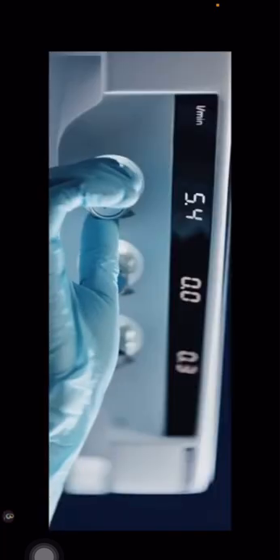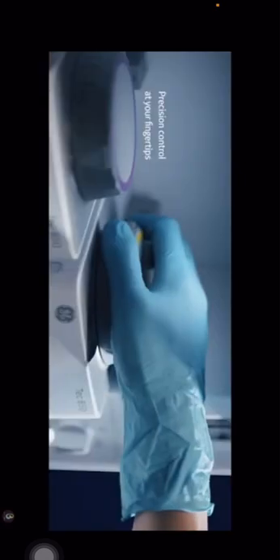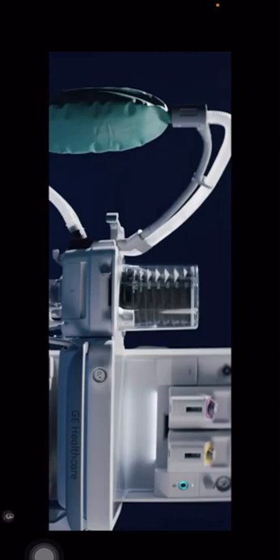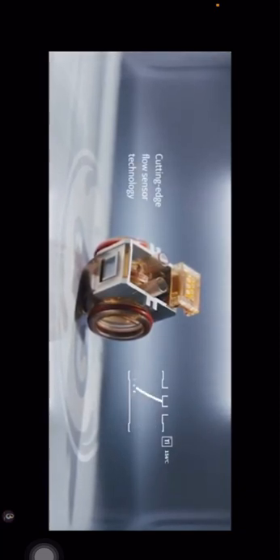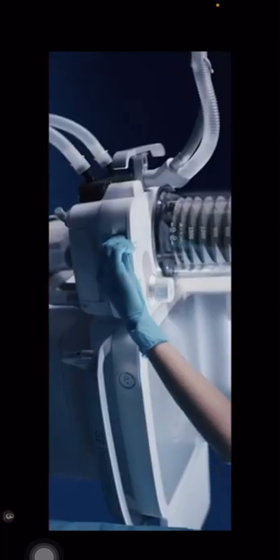The fourth type is the MRI-compatible machine. This anesthesia machine can be used in the MRI room to support patients manually. It is approved for use with up to 3 Tesla MRI scanners, and the MRI images are not affected by the operating anesthesia machine, nor is the machine affected by the MRI operation. This saves time and space and allows operators to respond quickly to patient needs.